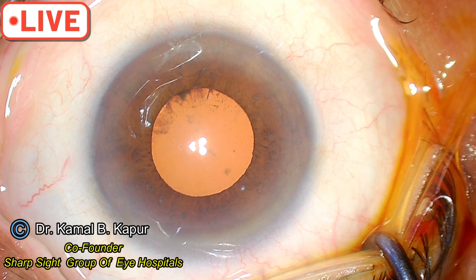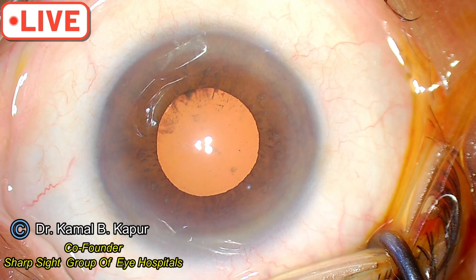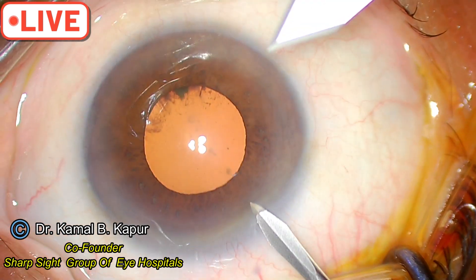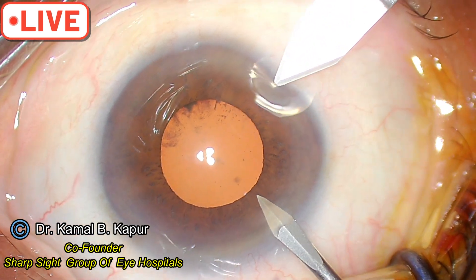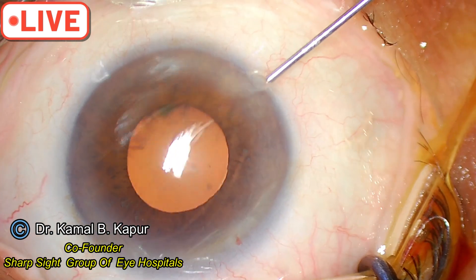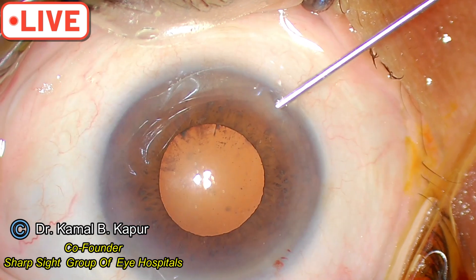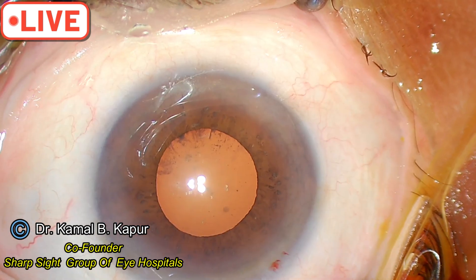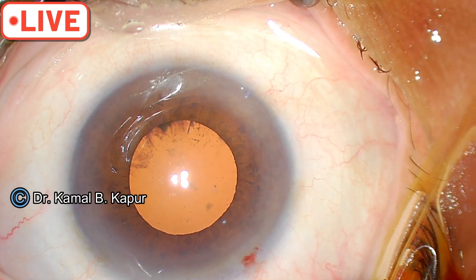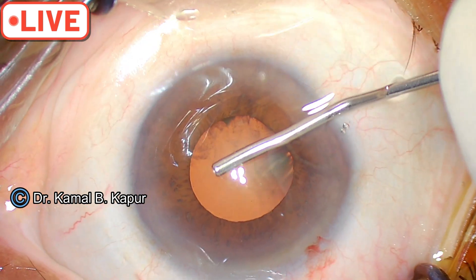We will demonstrate a technique for surgeons who don't have access to a pupil expander like a Malyugin expander, anchor expander, or Bhex expander. In these cases, stretch pupilloplasty will not work because the pupil is inelastic. We put some adrenaline epinephrine hoping it will work, but it shall not. So we will demonstrate a situation where a micro-sphincterotomy can be done.